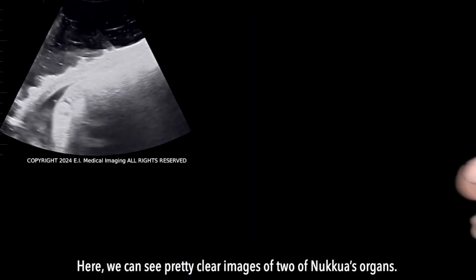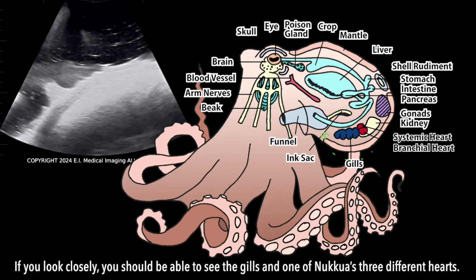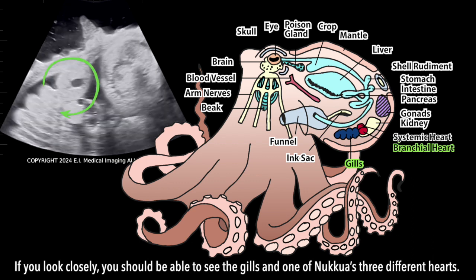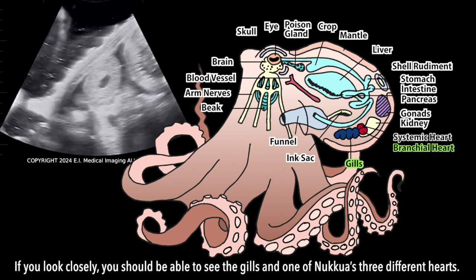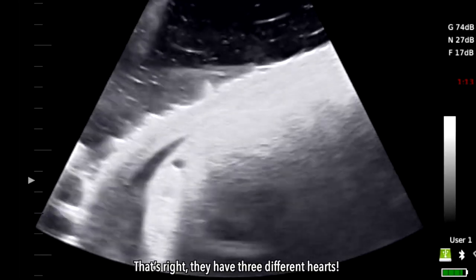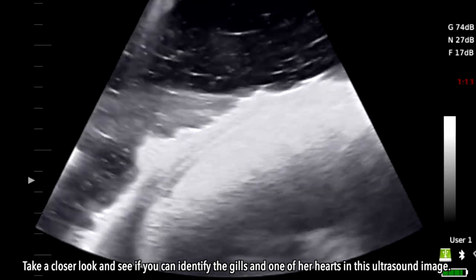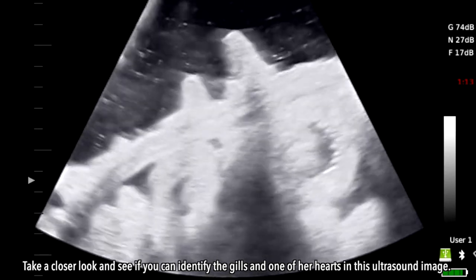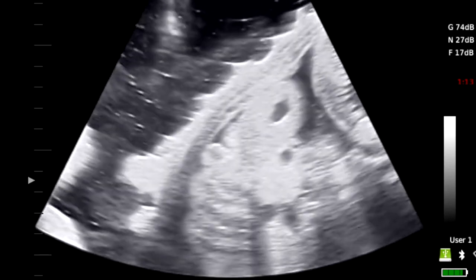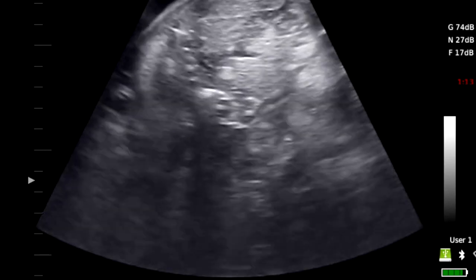Here, we can see pretty clear images of two of Nakua's organs. If you look closely, you should be able to see the gills and one of Nakua's three different hearts. That's right, they have three different hearts. Take a closer look and see if you can identify the gills and one of her hearts in this ultrasound image.